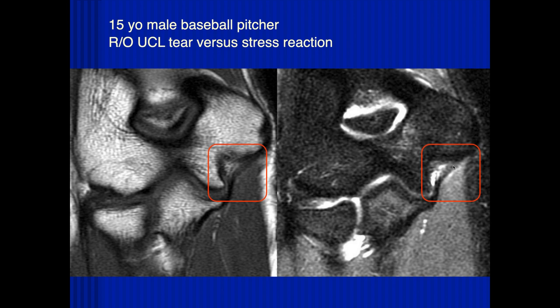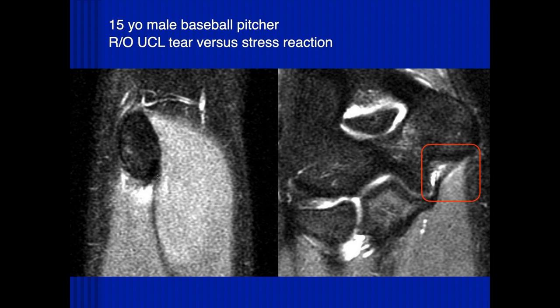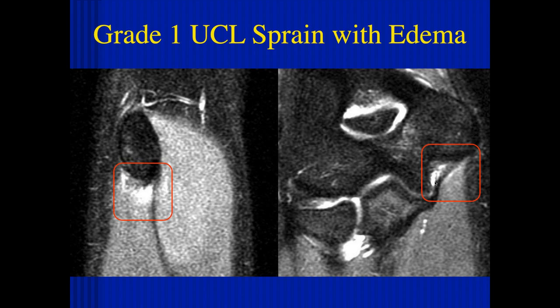We do see some edema on both sides of the ligament, which is not normal. On the sagittal images, we can see the ulnar collateral ligament and some of the tendon, with some edema in this area. These kind of findings — where it looks intact but we can see evidence of abnormal tissue injury — are typically called grade one ulnar collateral ligament sprains, in this case with a little soft tissue edema around it.